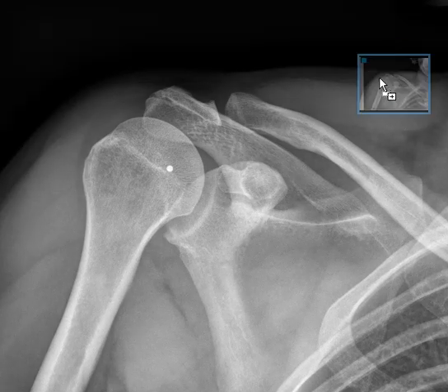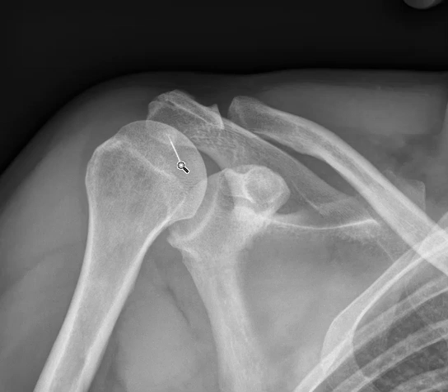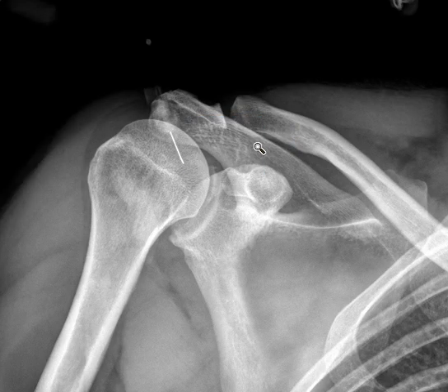We take a needle and put it in here. It's a 25-gauge needle, and we try to go mostly straight up and down. Sometimes we oblique it a little bit to get into the right spot. This is a pretty good spot — normally I like to aim a little bit more peripheral, but this is good enough. We inject the contrast, about 10 cc's, into the shoulder joint.